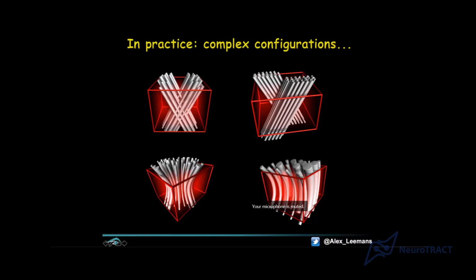And I kind of agree that could solve it. But in practice, our brain is also configured like left top. And if you look at the left top configuration, where they're genuinely crossing, then we would be looking at a very difficult multi-scale problem. Because if you were to take smaller voxels, even in those smaller voxels, you would still see crossing fibers. Okay? And I'm going to showcase this with an example.